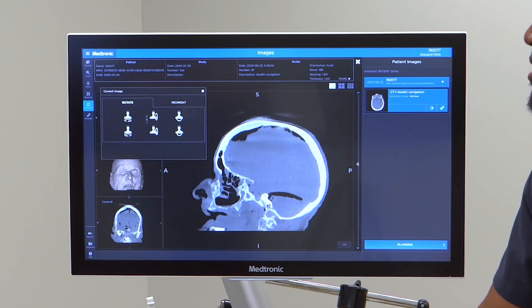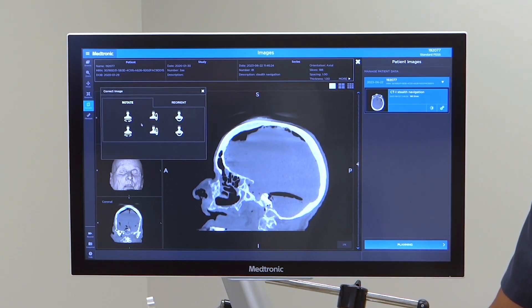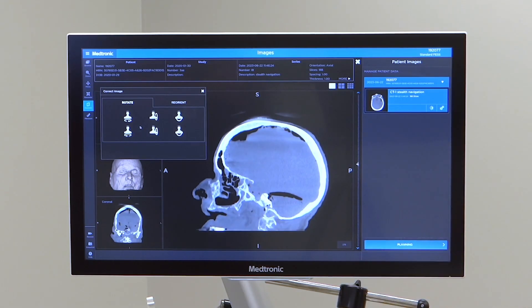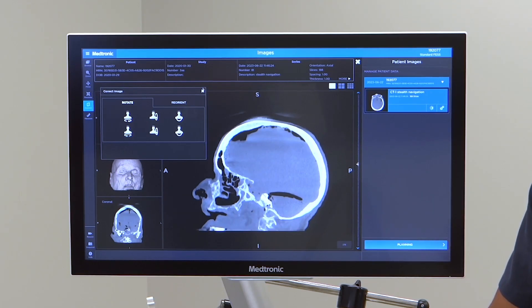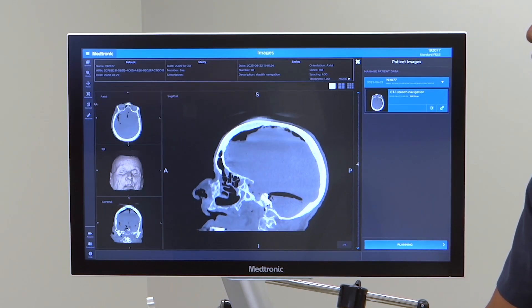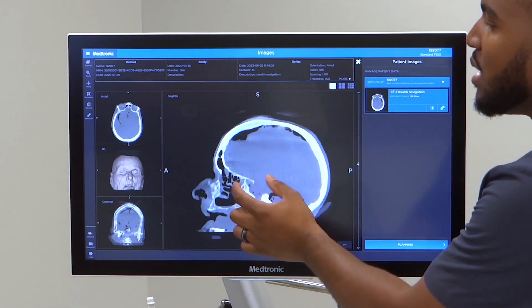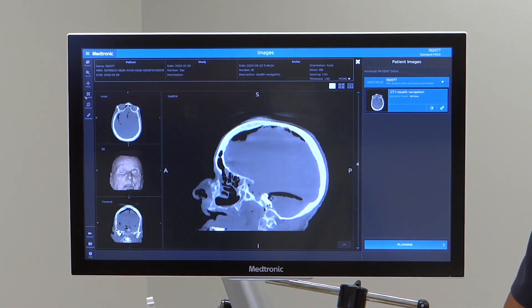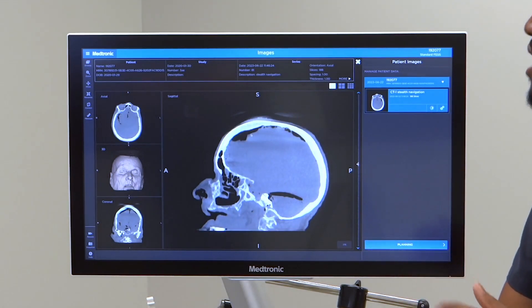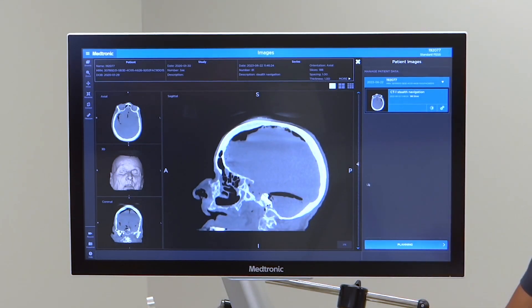You can also correct the scan if for some reason it isn't accurate to what the patient is showing on the table — you can rotate and reorient as needed. After correcting, if you zoom in too much, you can recenter and then move it around and browse through the slices.